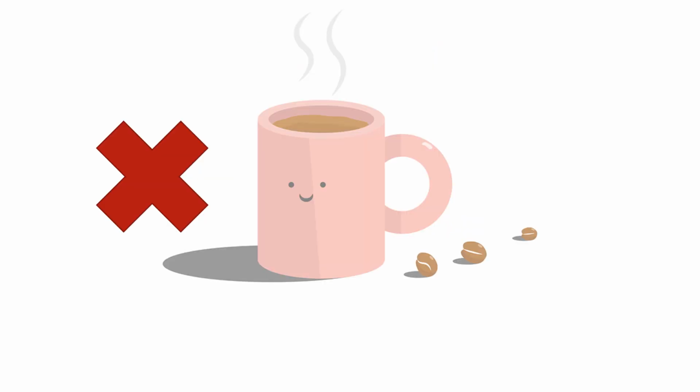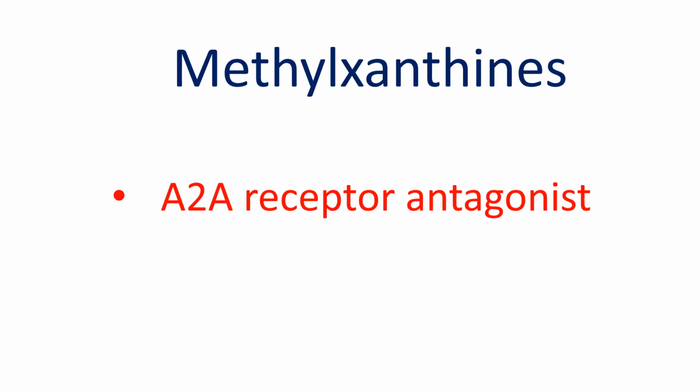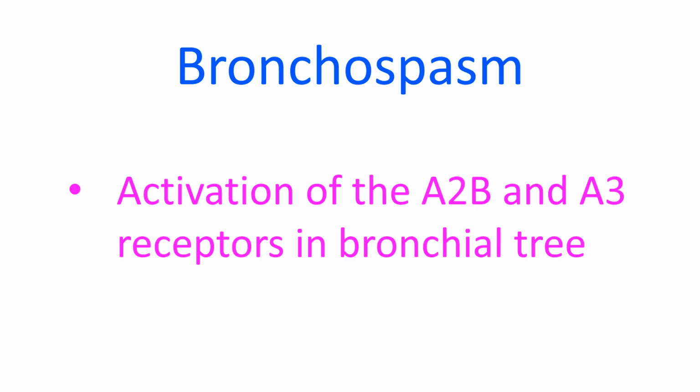Caffeinated drinks are avoided for 24 hours prior to the procedure. Any medications containing caffeine also have to be avoided. Asthmatics on theophylline preparation will have to hold it for 48 hours. Methylxanthines, theophylline and caffeine block adenosine binding due to antagonist action at A2A receptors and can reduce the coronary vasodilation effects of adenosine. Of course, adenosine cannot be given in those with reactive airways disease with significant wheezing.